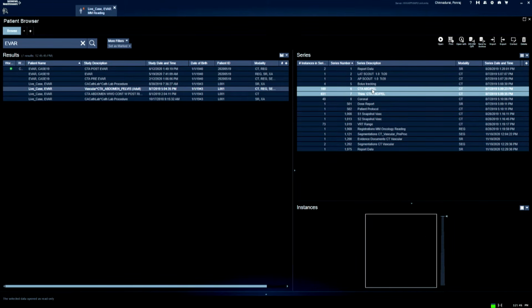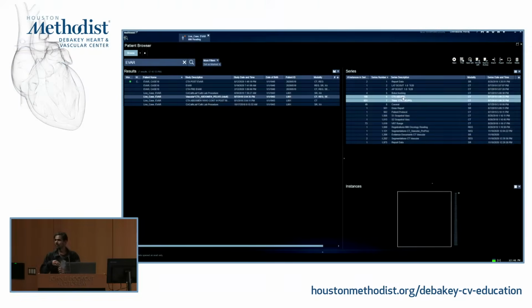You can actually go back and get it. So for example, you're trying to build a fenestrated graft, and you want to be really accurate, you need the 1.5 millimeter slices, and they often exist, but not for your viewing. Do they? That's the question I have. Do they always exist? Or do sometimes, when they store it, you actually lose them?